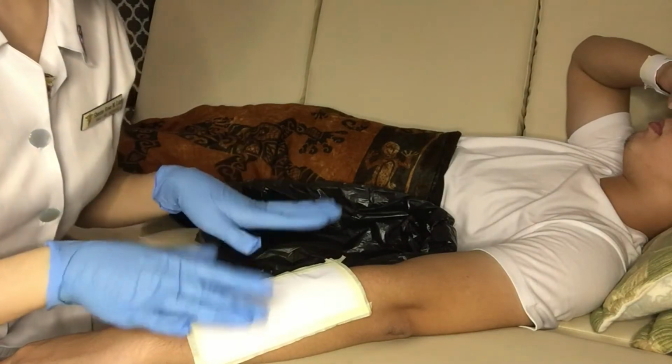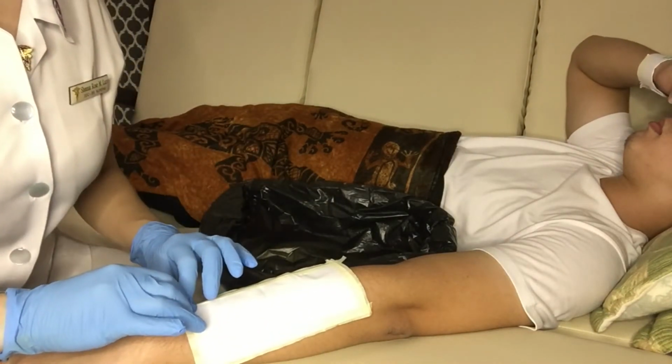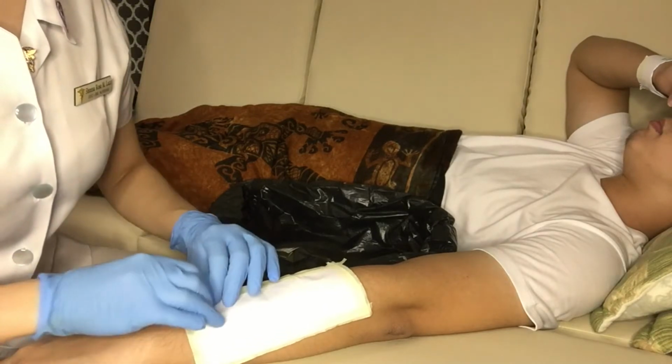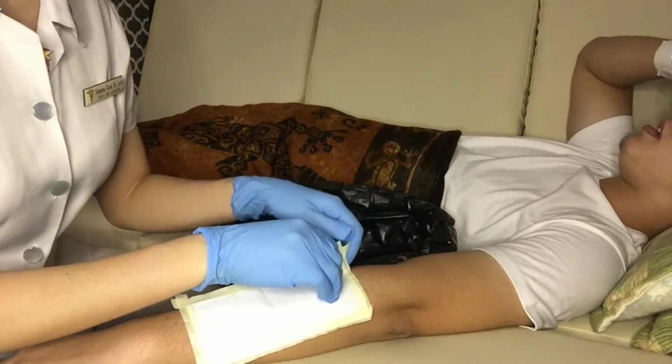Step 5. Expose area near wound only. This allows to preserve the dignity of the patient and also to provide privacy and comfort. So first, we have to remove the old dressing by peeling up the adhesive from the skin by gently tugging it. Sakit, sir, ano?